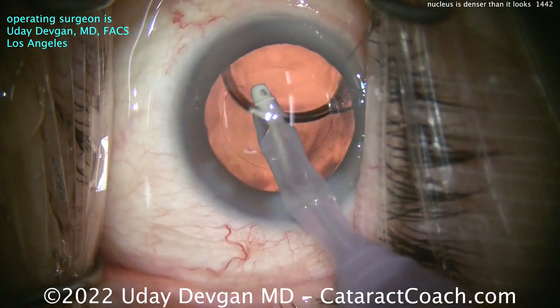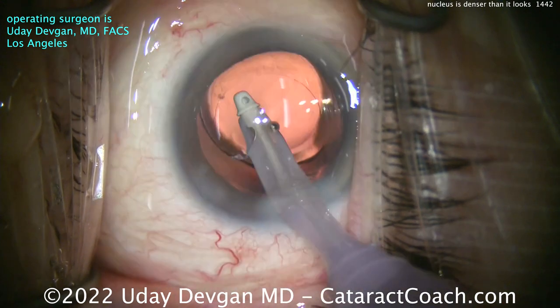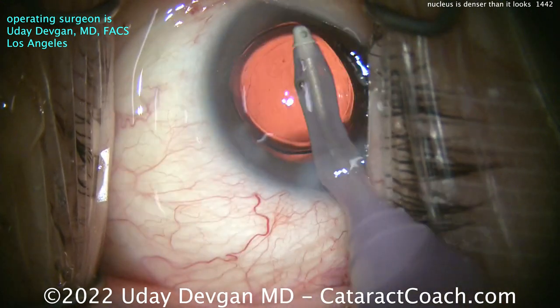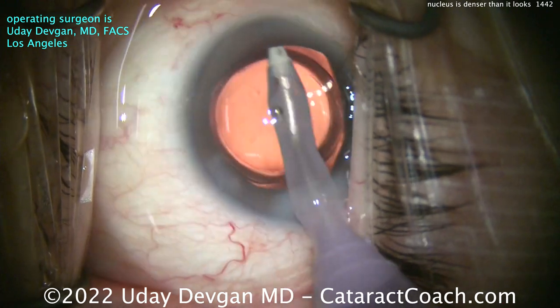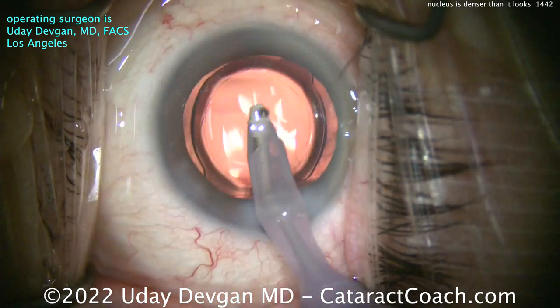Let go of that posterior capsule — when you see that sign, you better react quickly. Now cleaning up all the viscoelastic from behind the IOL. We'll do a little more polishing of that anterior capsule rim to make sure we have a nice clean capsular bag. That really looks pretty.